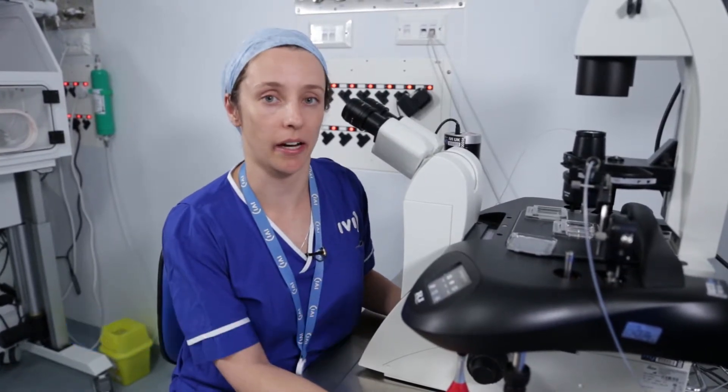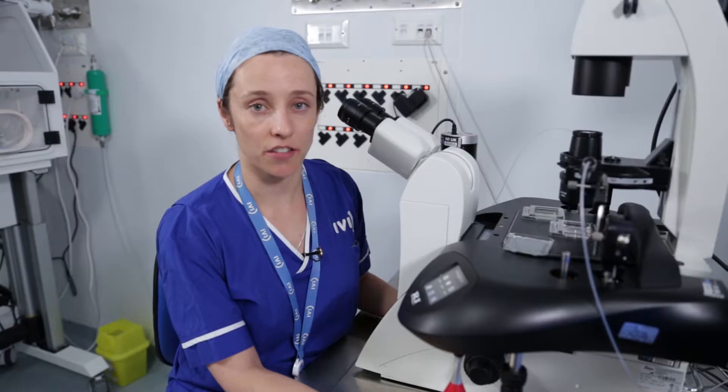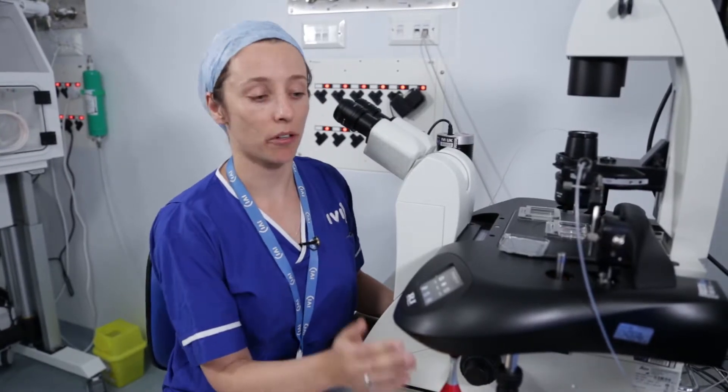We perform embryo biopsy on day five or six of your embryo's development, depending on whether it is suitable for the procedure at that time. We make a special dish for each embryo and place it up on this streak here.